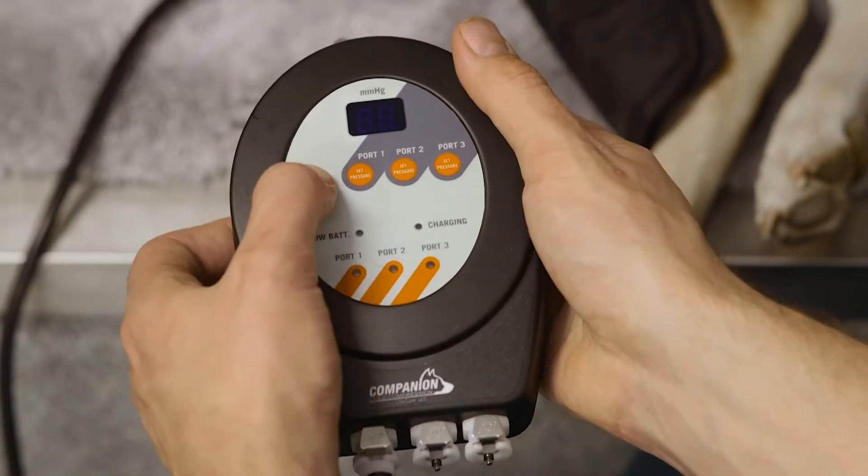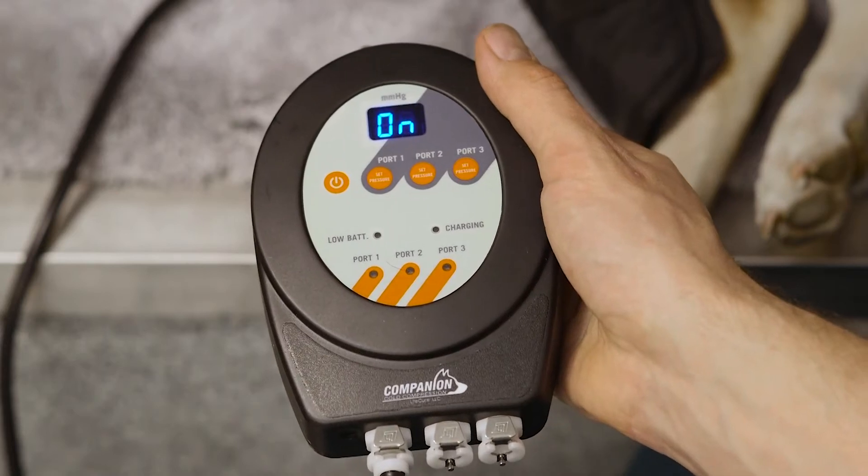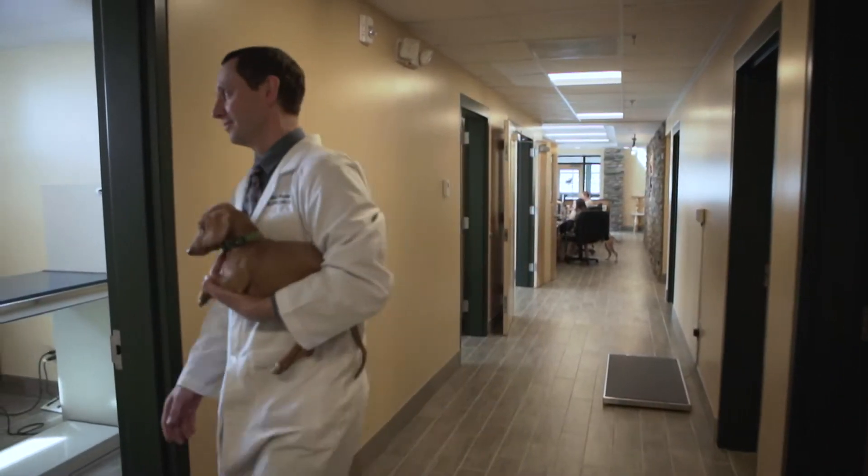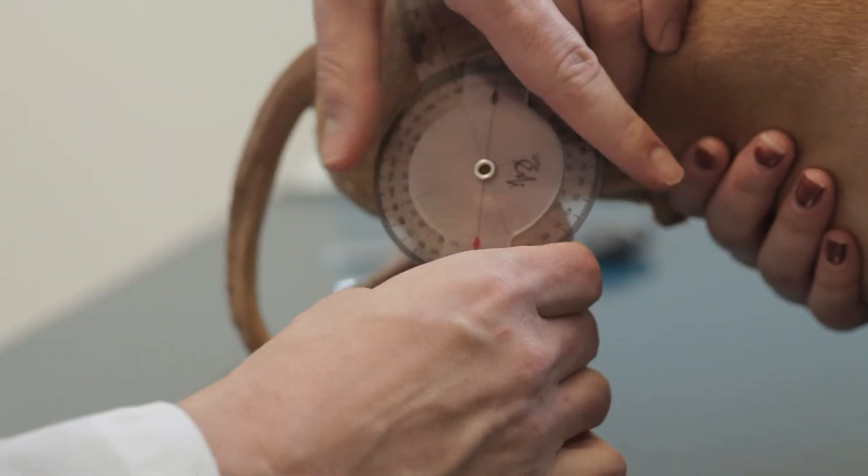The variability of the pump to allow us to treat multiple areas on the patient at the same time cuts down on our treatment time and allows us to spend more time doing other aspects for our patients. This not only helps the patient, it helps our staff and team, but it also helps the owner at home because we all know that there are only so many hours in a day.